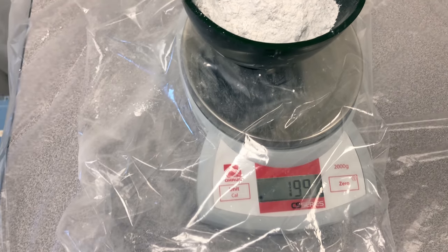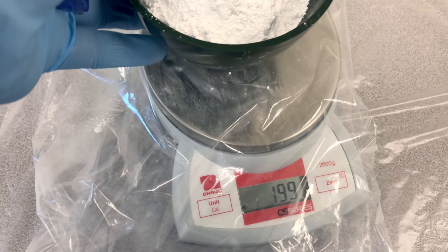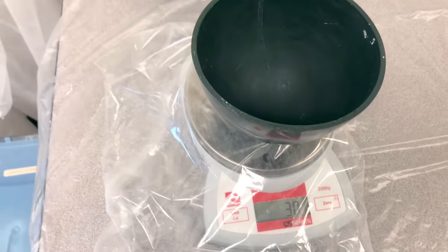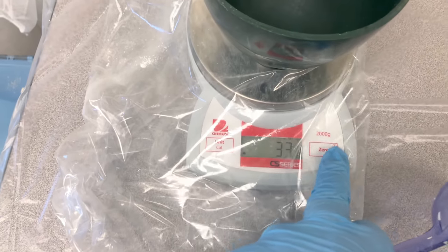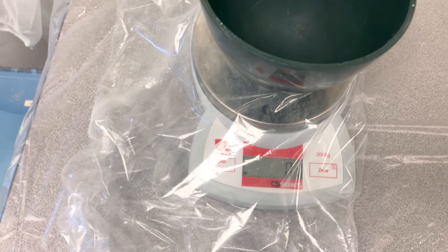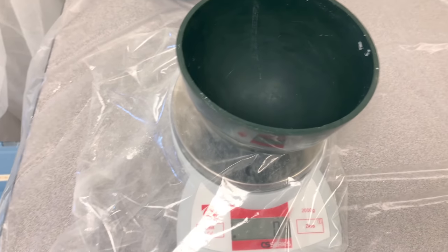We'll call that close enough. If you're within one or two grams, you're good. Take the other measuring bowl — since this is a larger bowl, it weighs more, so zero it out again. Now add your 200 grams to measure out your powder.